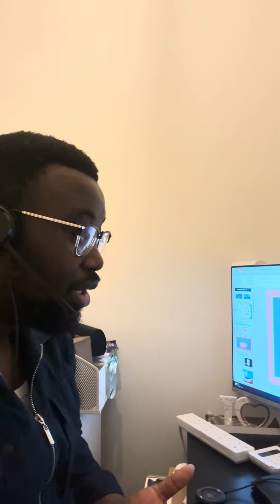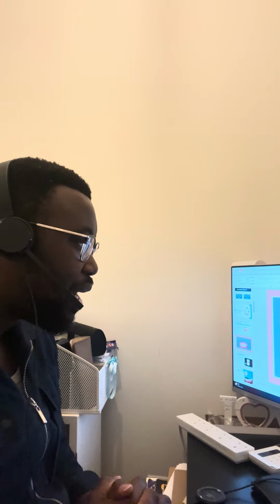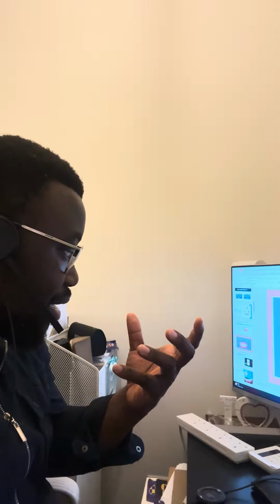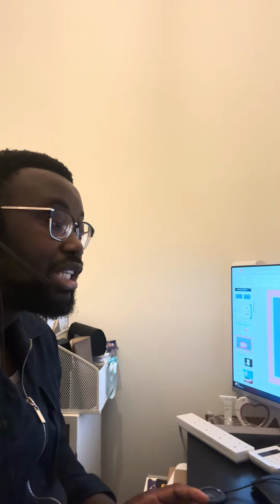If you like, you can look at this as the anatomy of a digital denture. Try to study this. You can see all the different parts labeled, and you can see how accurate it looks, even though we have not fitted it. It's only a picture, but you can appreciate visually that this product seems close to perfect and looks very comfortable and aesthetic as well, with minimal errors.